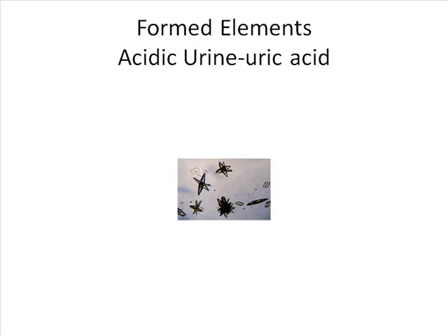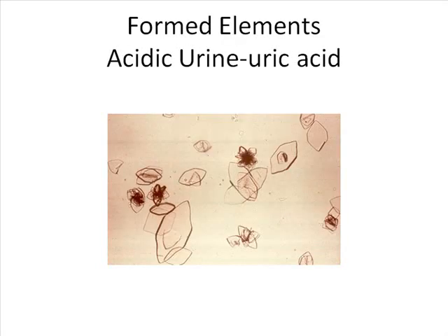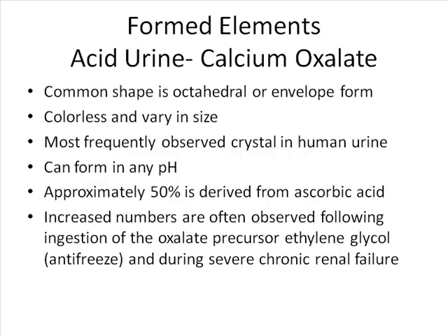All right. This picture doesn't give it the good idea that you should, but you can also look at these little cross or Star Wars forms, I call them, and then you have the little football forms. Here you have then these plate-like forms. Yeah, and here you see more of the football forms. See these? And then as it sits, they kind of gang up, and you get this little form that looks like it's forming into a ball.